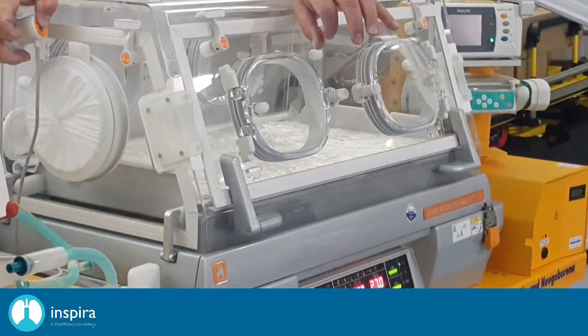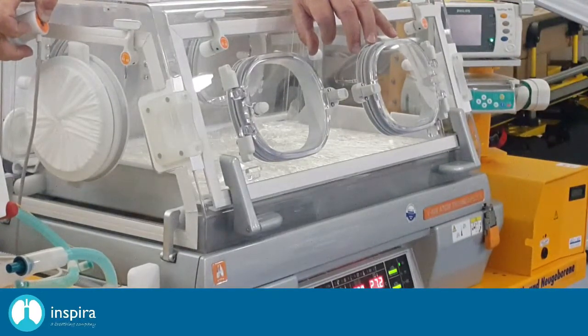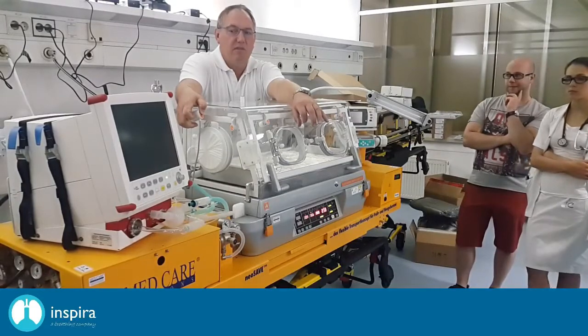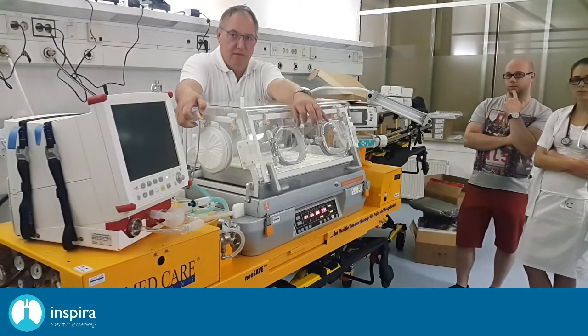The other option to insufflate inside the incubator is that you are doing a connection between the ventilator and the incubator. Do you have high flow therapy on it? No, because there is no humidifier. What? No humidifier. Yes, there's no, but for insufflation? You could only do insufflation. Okay. But you have no option to get mixed gas from the ventilator? As a single limb delivery of gas. Yes. To the incubator. Yes.